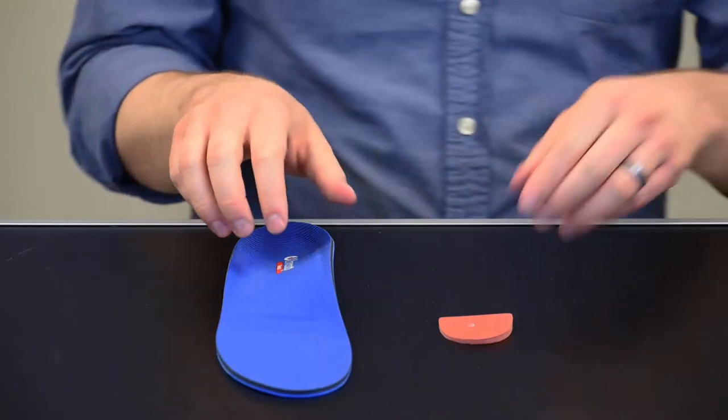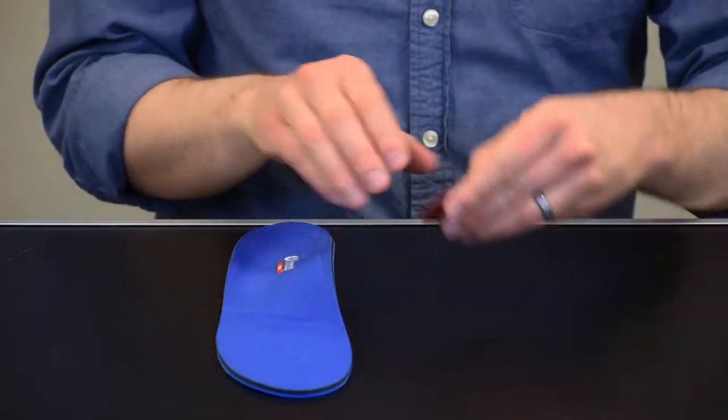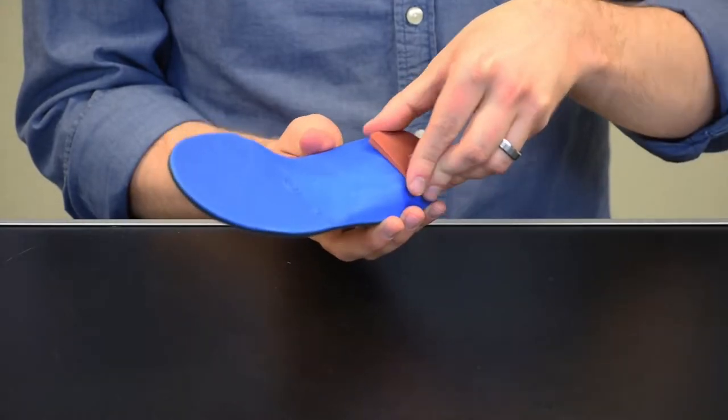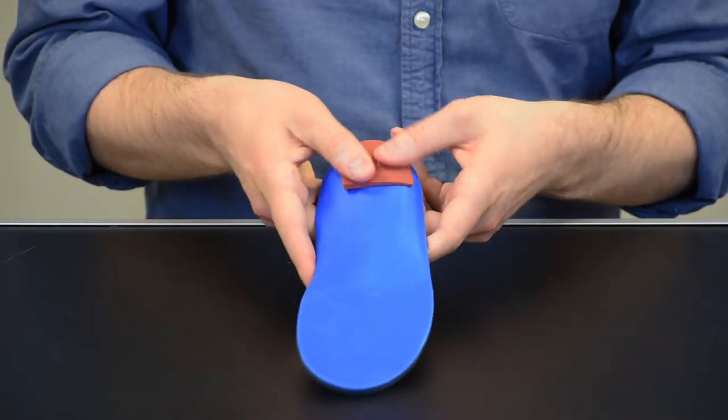To apply, select left or right as designated, remove the adhesive backing from the wedge, and apply firmly to the underside of the orthotic's heel platform. If necessary, adjust the position for comfort.